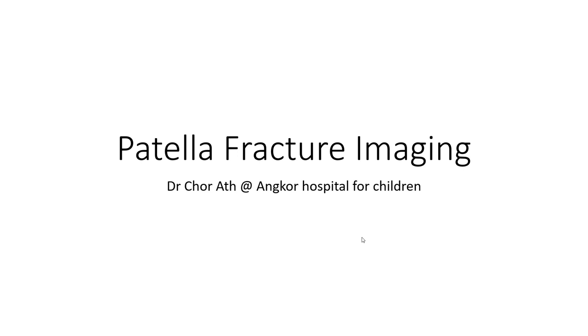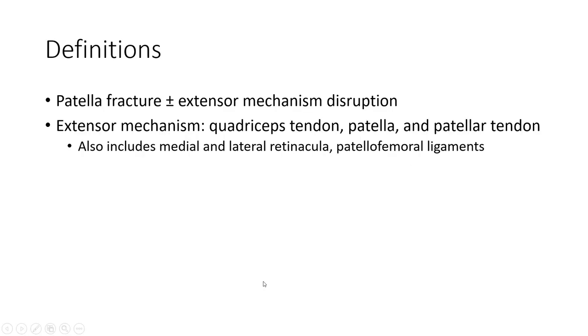Hello everyone, today I'm going to talk about patella fracture imaging. Definition: patella fracture plus or minus extensor mechanism disruption.